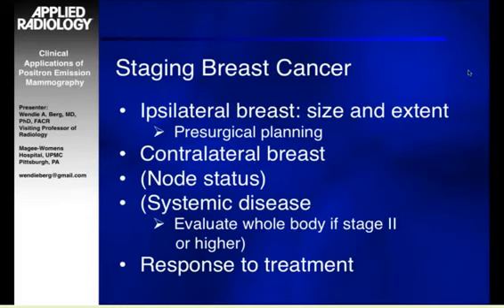We're also, of course, interested in the contralateral breast. I think with the results of the ACOSOG Z11 trial, we're less interested in the axillary node status, but we can discuss that if there's interest later. And finally, with whole body PET, of course, there's the option to look at systemic disease. And I will just mention that one thing that is possible is to do whole body PET imaging followed by PEM with the same injected dose, although that may not be reimbursed, but it's something worth noting for the future.